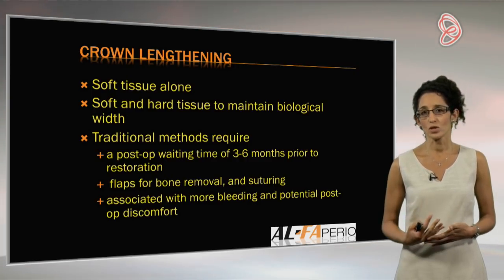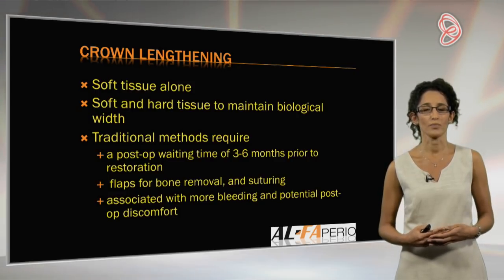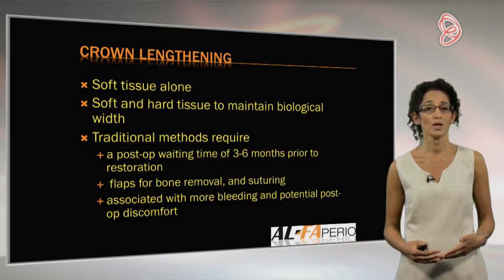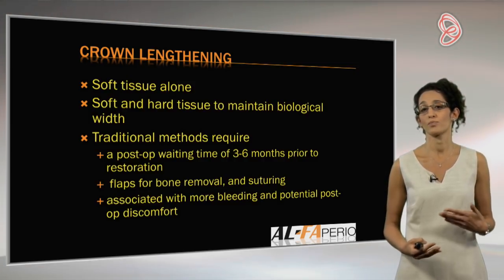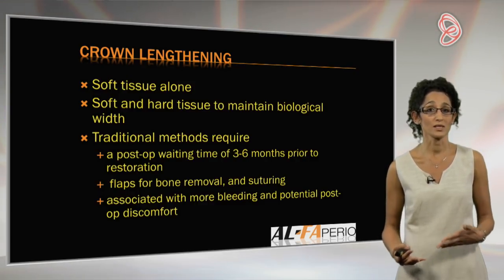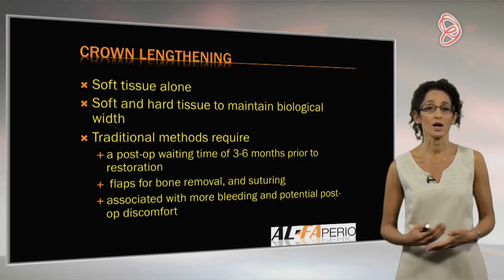So when we do traditional crown lengthening, what I would have done pre-lasers is I would always look at cutting, of course, with the scalpel blade, getting my tissues to the right shape. Then I'm going to raise my flap, with periosteal elevators and so on, remove my bone with a handpiece, so burr to bone, put my flap back, suture it up.